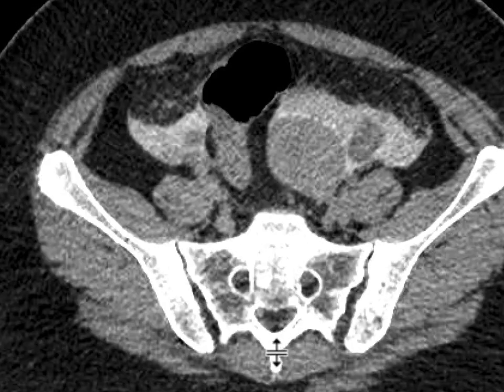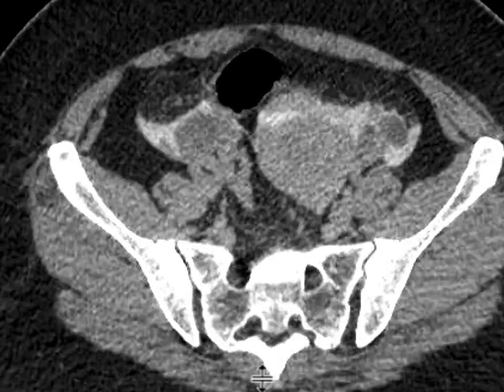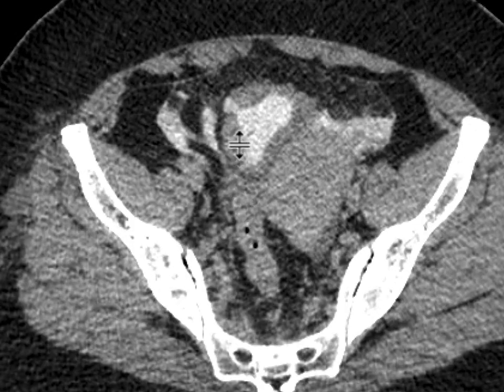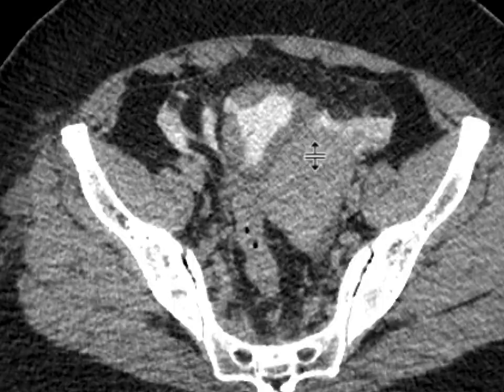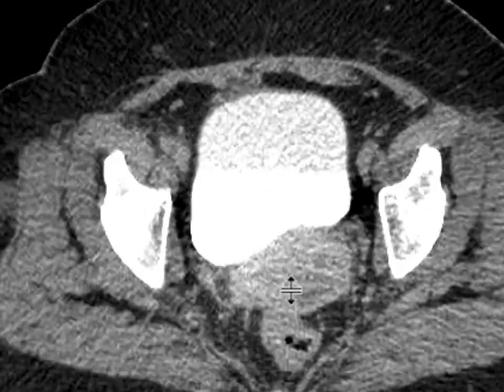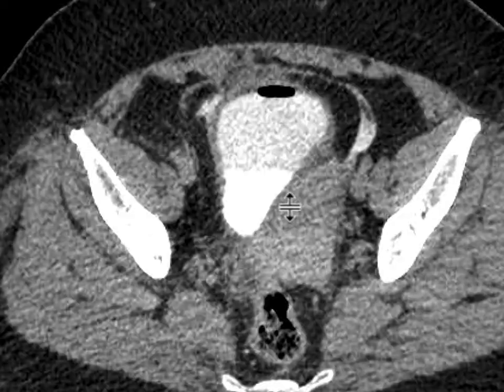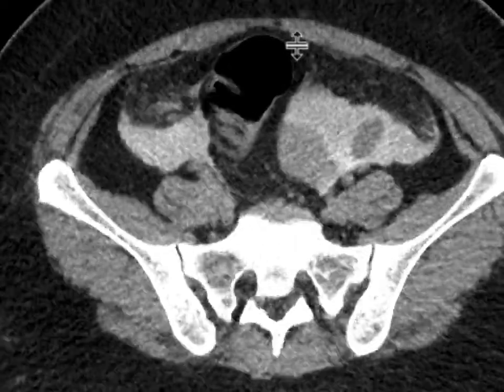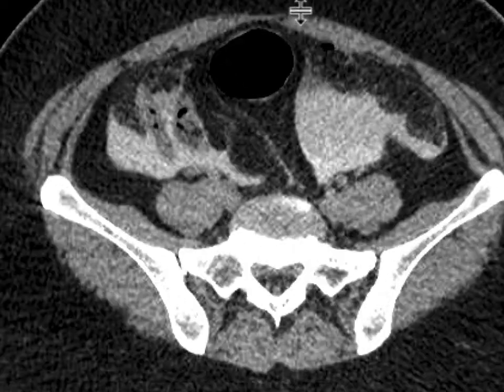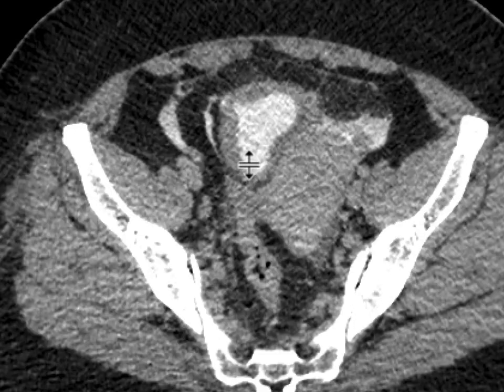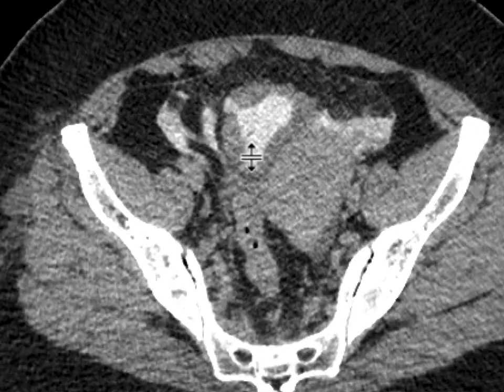Going all the way down, we can see high-density contrast, and right here at the anterolateral aspect of the bladder dome, a very discrete defect compatible with a bladder injury. Given the location and distribution of contrast, this is compatible with an intraperitoneal bladder rupture, for which surgery is required.